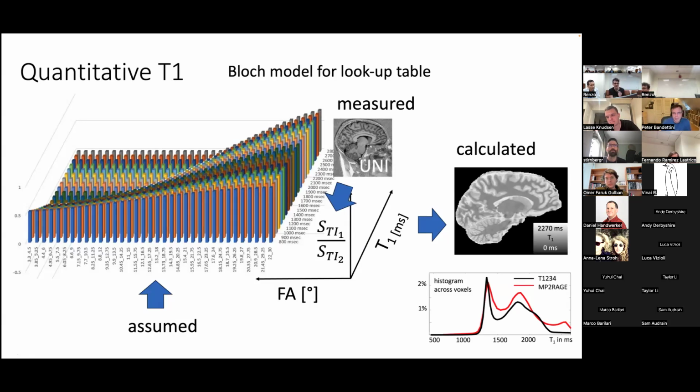So what we did, we used a template of T1 for that coil in that scanner, which is extremely consistent across people, and then registered that and did basically a universal pulse model in the analysis, not for pTx, but in the analysis, which seems to get rid of almost all of that, which does not come across in this slide. Yeah, that's a big point. So if we add a B1 plus map as a template or something, then maybe it gets clearer. And also the B1 map takes like 20 seconds. So yeah, that's a good idea, actually.